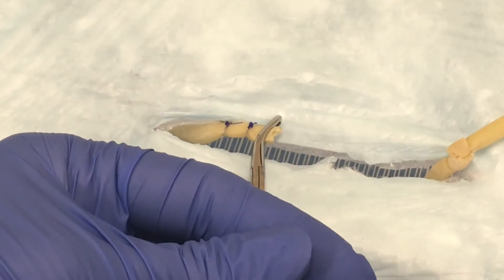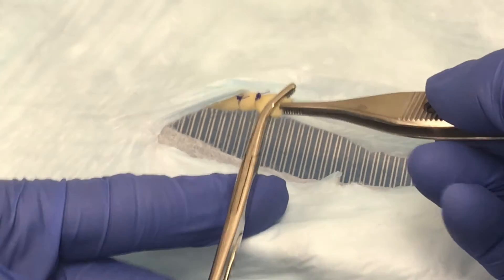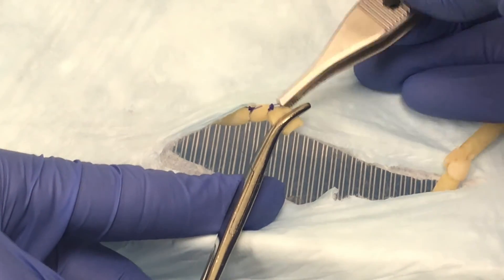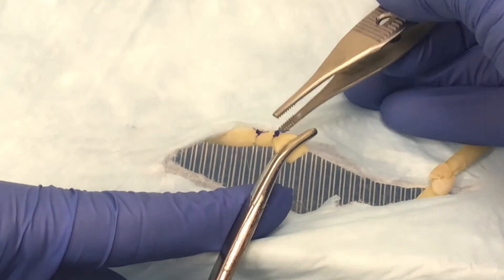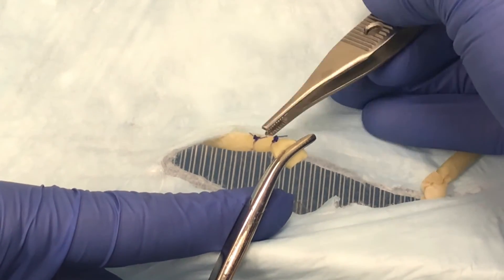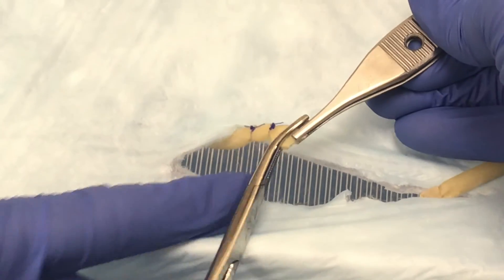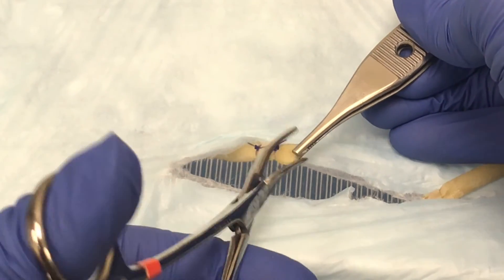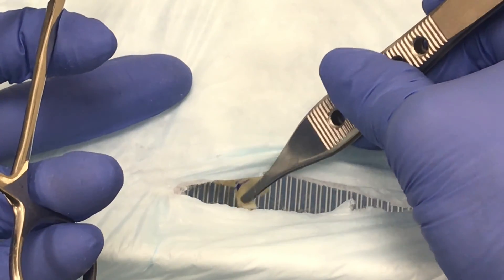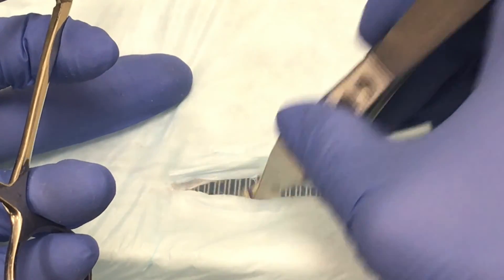I'm going to pull this back and grasp my pedicle. You always want to grasp either distal to your clamp, between your clamp and your ligatures, or worst case between your ligatures — but never on your ligatures or proximal on your ovarian pedicle. I'm going to grasp here because I have enough tissue. I'll open this up, make sure I don't have any bleeding, then slowly let it retract back into the body wall, taking off tension on those vessels and confirming there's no bleeding.